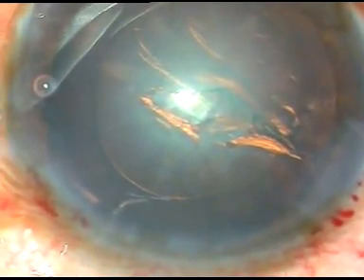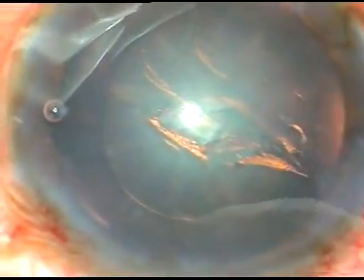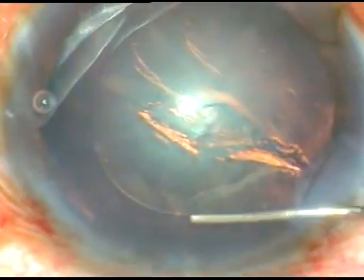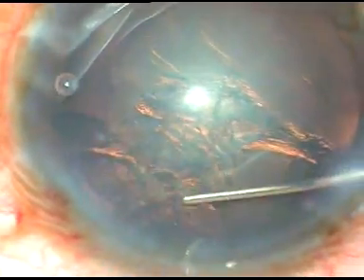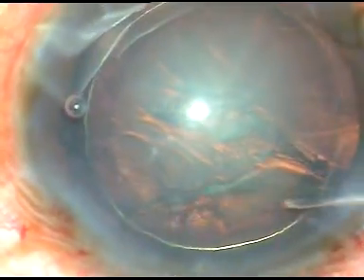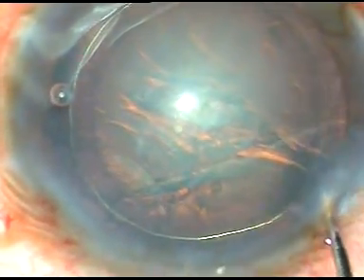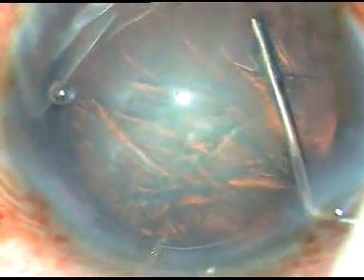Now hydrodissection is to be done. Cortical cleaving hydrodissection. Here it is. Fluid wave is passed just underneath the anterior capsular rim, and we can see that the fluid wave goes from one side to the other side. I did hydrodelineation also, which has produced a good golden ring in this case.